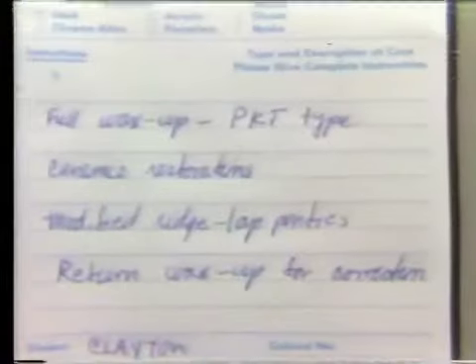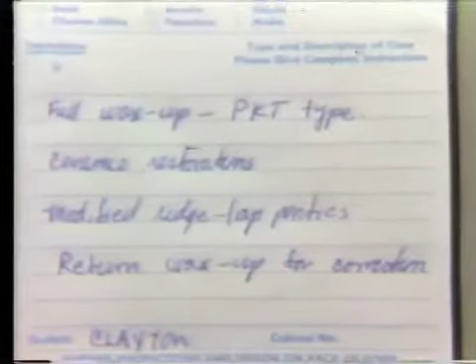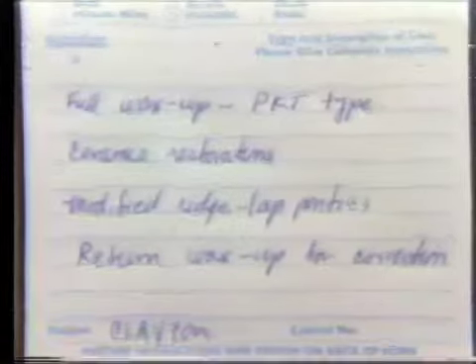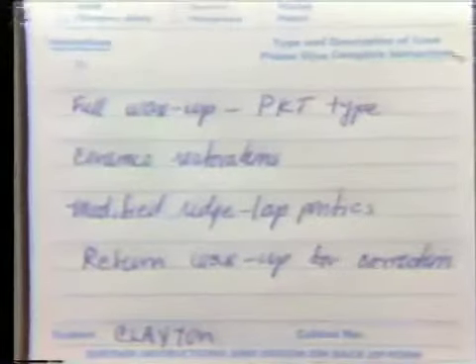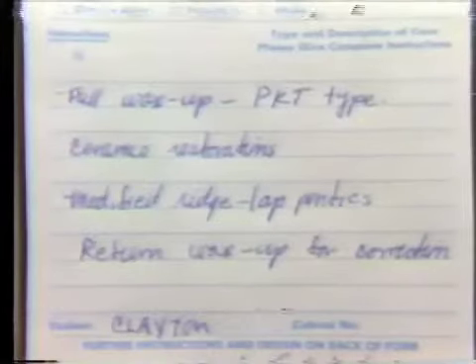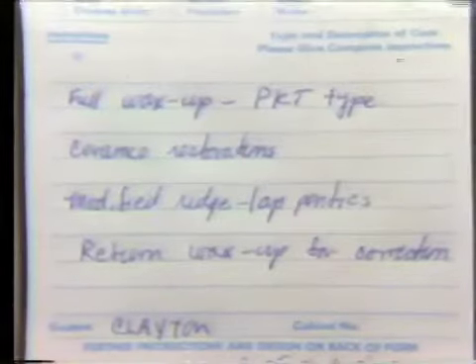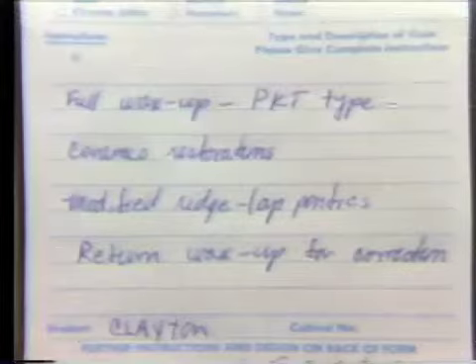So what you want to do is to put down the pertinent information and to give the laboratory technician that information that he needs to complete this segment of the laboratory procedure. So you can see here what we're going to do is send this case to the lab now and have him return the full wax up for correction. So we only give him the information that he would need to know in order to do a complete wax up. Now we do a full wax up, anteriors and posterior teeth, because the posterior teeth are used to tell how much lingual concavity we need on the anterior teeth. So we will have a full mouth wax up by the laboratory.